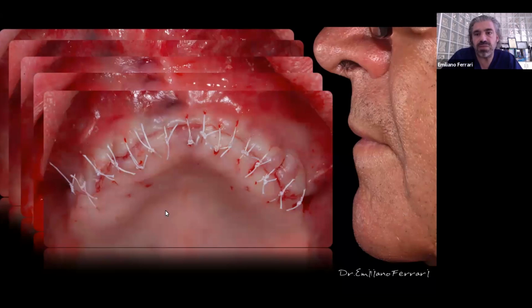And Gianni, some slides ago, told you that you can use a cantilever, but not as you want. You have a rule that you have to follow in the dimension of this cantilever. So in some cases, when building a fixed rehabilitation, you need a very long cantilever. Maybe it's better to think of a removable rehabilitation.